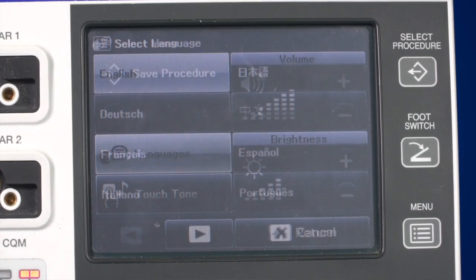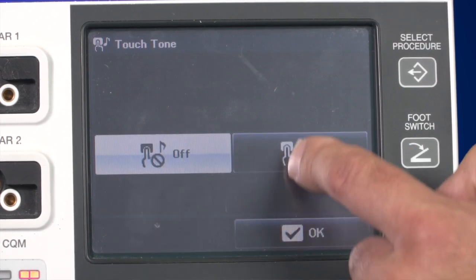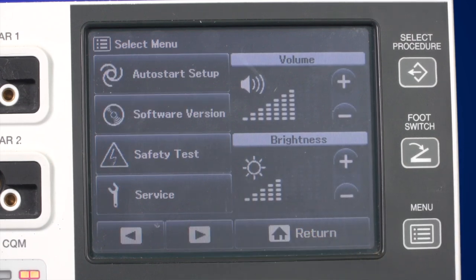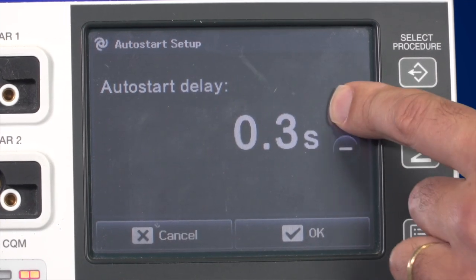You can also choose between 8 different languages. The touch tone button allows you to switch the touch tone feedback on and off. To scroll to the next page of the menu, use the arrow button. With Auto Start Delay, you can set the time at which the activation of Bisoft Coag starts after grasping tissue. The other buttons in this menu area are for Olympus service technicians only.